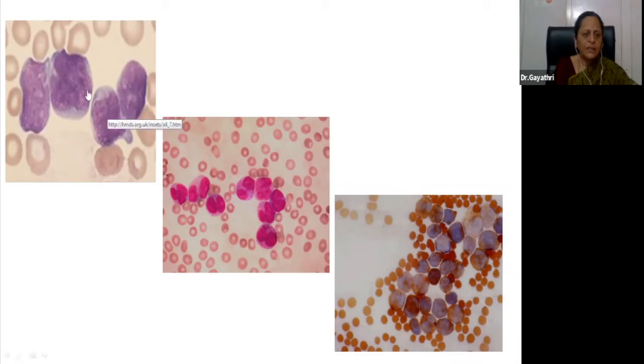Another population of blasts, you would know that these highly lobulated nuclei with prominent nucleoli here, you would have already come to a conclusion in your mind. These are monocytoid blasts. Okay, but here, what do you see? You see lobulations like in this textbook case. I put a textbook case just so you can compare it. Look at these lobulations. They look quite like these, but there is something distinctive.